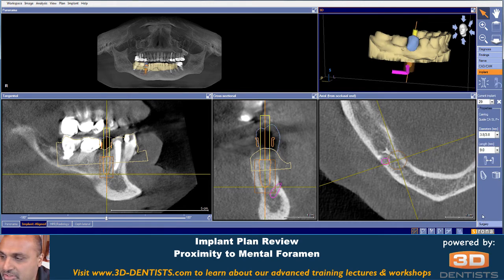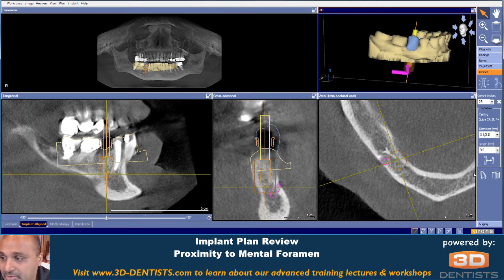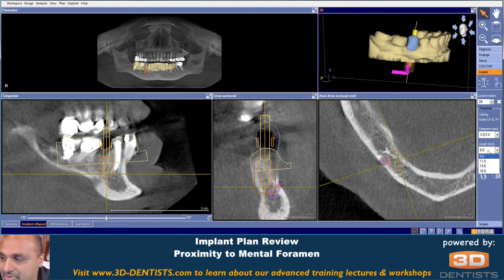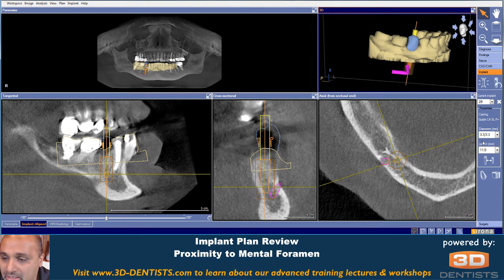Now on to our implant plan that was submitted here. This particular person is using the CAMlog guided implant 3.8 by 9 millimeters in length. That is the shortest implant they make and not quite the thinnest implant that they have.